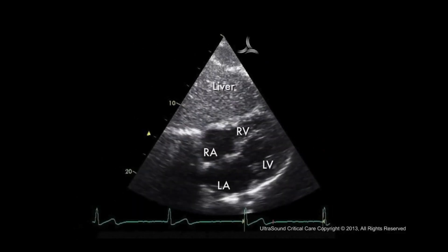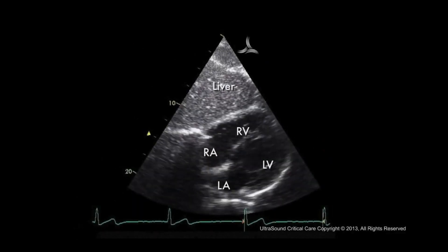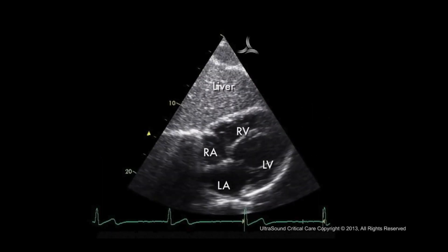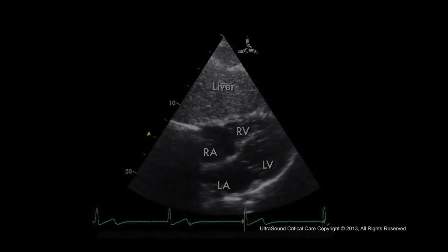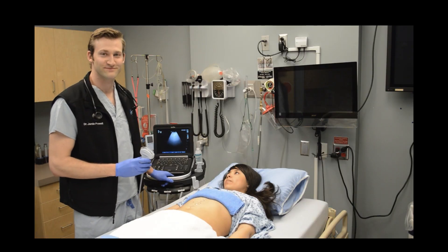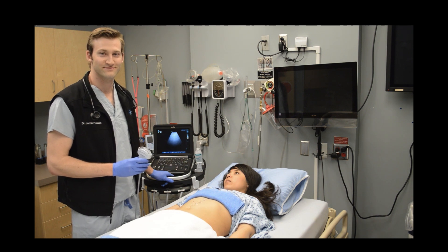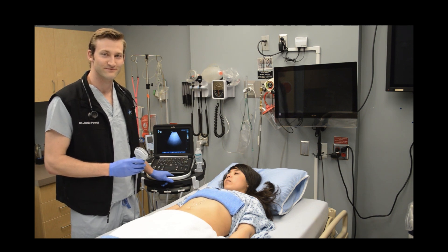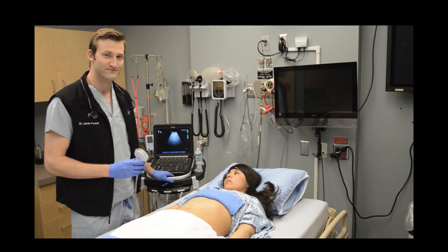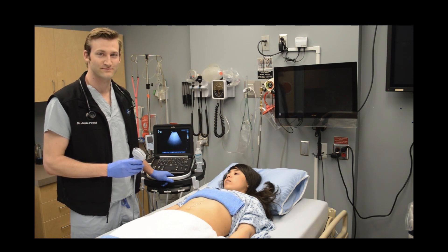This image is labeled as the right ventricle, right atrium, left ventricle, and left atrium. The goal of the subxiphoid view is to provide a brief and limited evaluation of gross cardiac contractility and to check the pericardium for fluid.